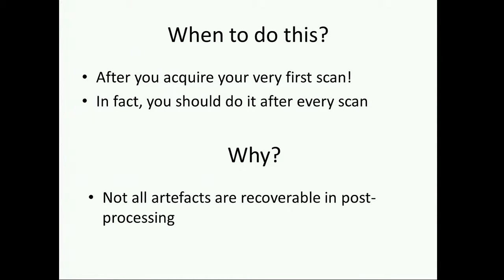Okay, I said this before, I'll say it again. When should you do this? After you acquire your very first scan, I would run it through, I would look at it, I would run it through your entire pre-processing pipeline, and I would make sure it works. You should probably do it after every scan before you acquire the next one, if you're being really honest with yourself, but I would definitely do it after you acquire the first scan. Why? Because sometimes you cannot get those data back, and there's nothing you can do about it.